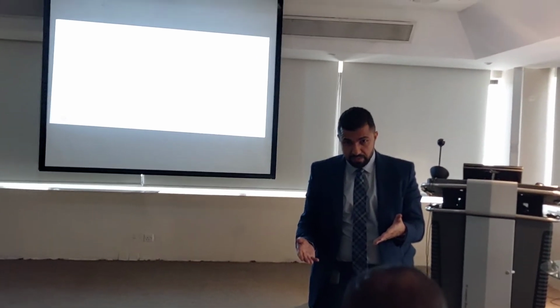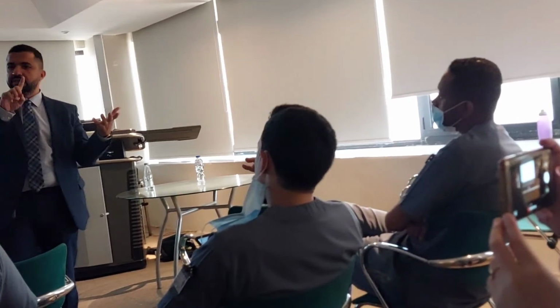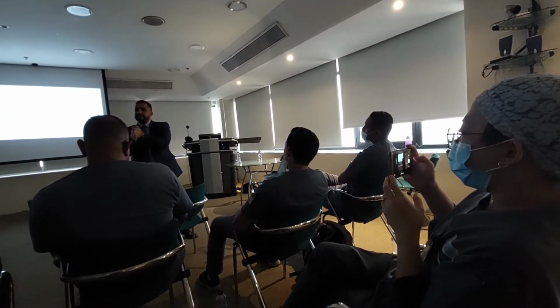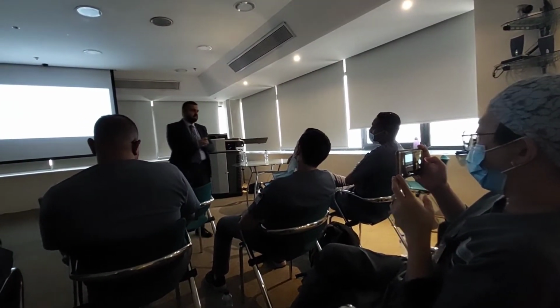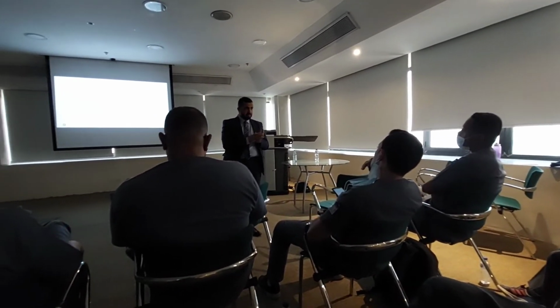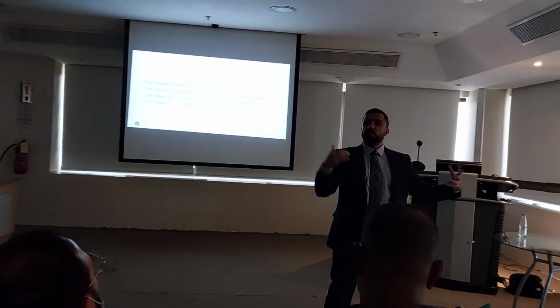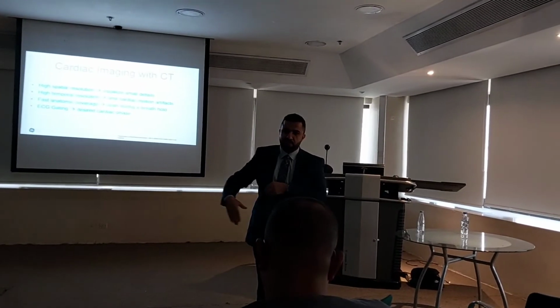Is that understood? Okay? Now, because it's not good quality of ECG gating, it's not a good signal, it will not be still images. It will be full of motion, not actually collecting data from the index. You get that? Okay? So, for that, I need good gating so as to get all the other features.